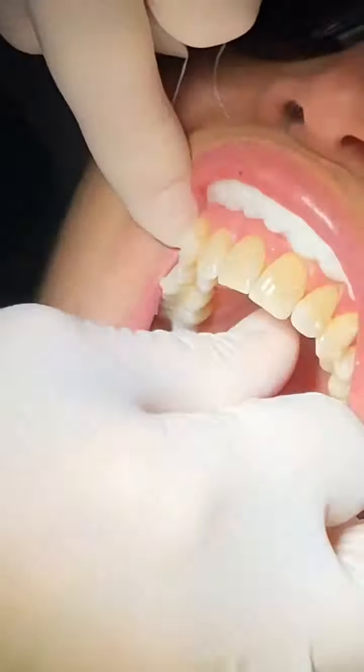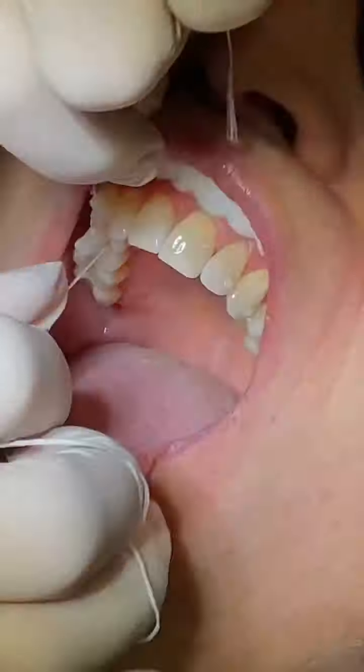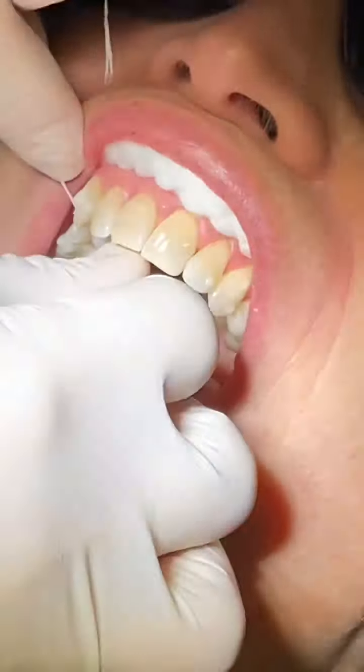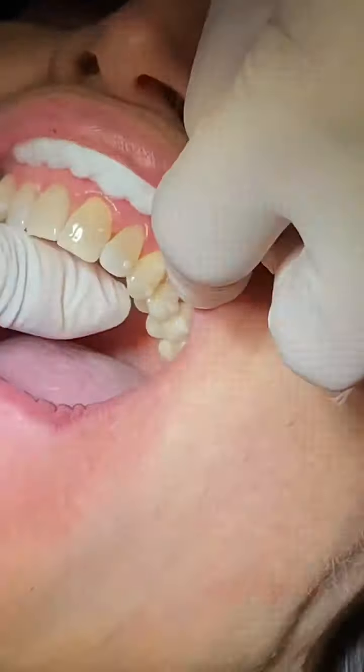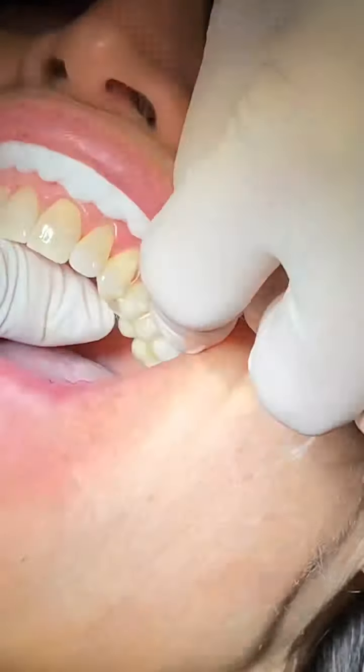As the last step, we use floss to make sure there's nothing in between the teeth. There rarely is, but you want to make sure everything is as you wish, so this is a step we never leave out.